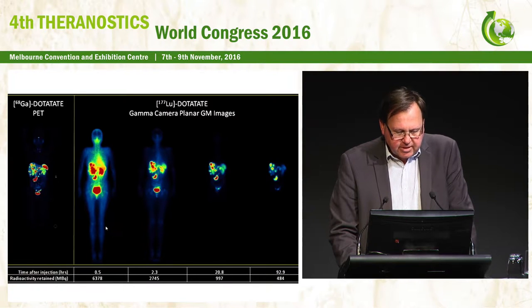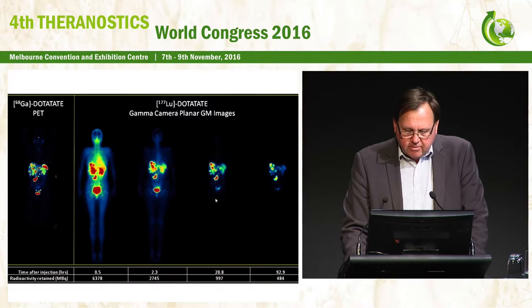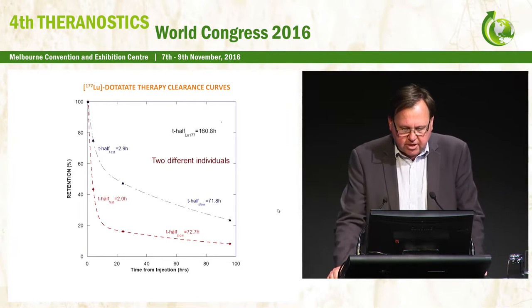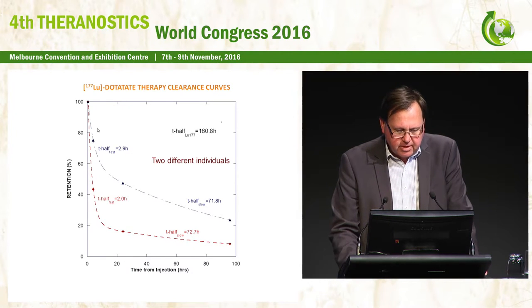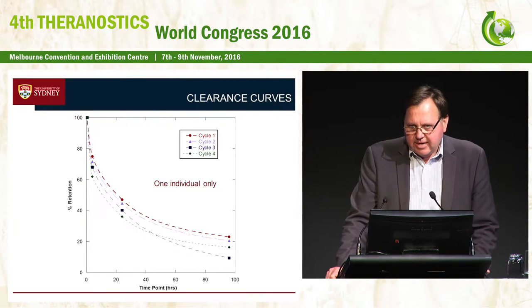This is the uptake of the lutetium dotatate immediately at the end of injection with 100% of the activity remaining in the body, and then over two and a half hours later, roughly 24 hours and 3 days later. And so we've done a lot of work with these data to look at retention, and two different individuals shown here, one with a very rapid clearance early on and then a slow component, and this bi-exponential nature is what we see in all of the patients here, a faster initial clearance and then the longer slower part there. It is terribly, terribly reproducible.